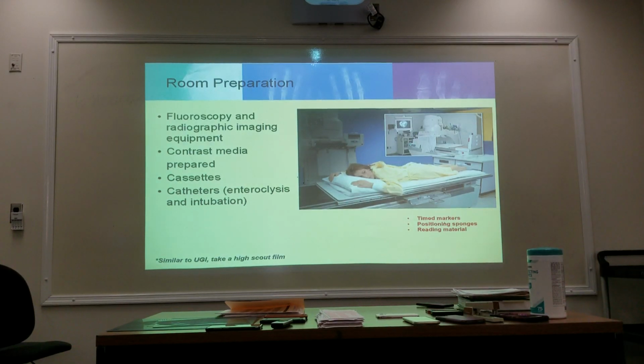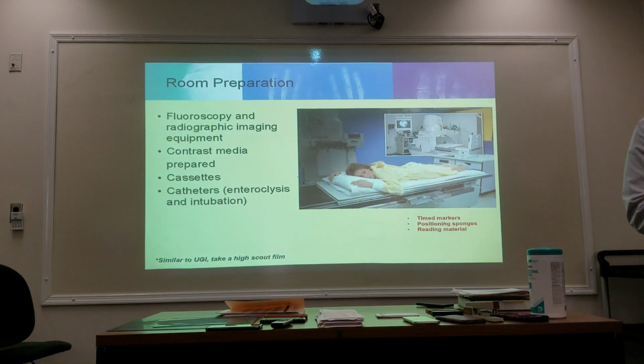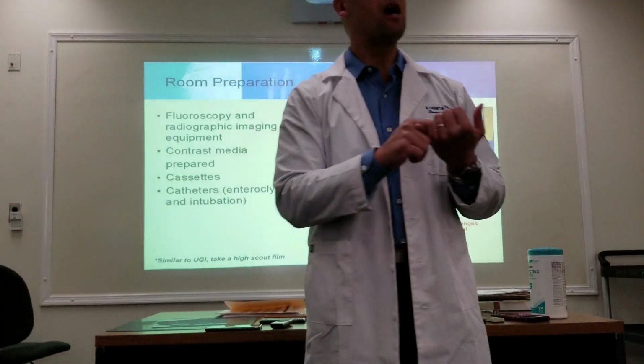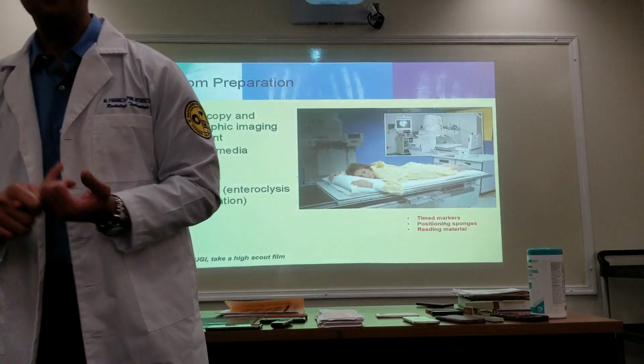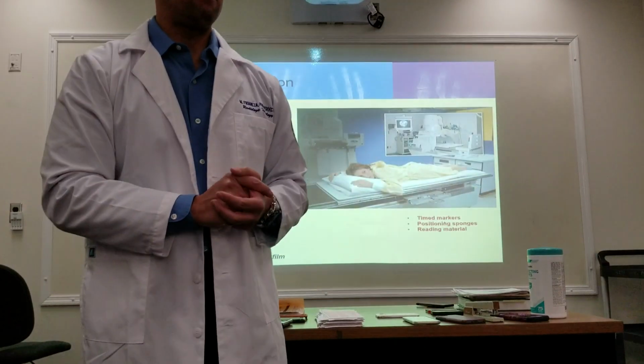So the scout film just lets us know that the patient has been properly prepared for the procedure, and it also helps us identify any type of anomaly before the patient ingests contrast. Because if there's anomalies in there and they drink the contrast, we no longer see that anomaly.